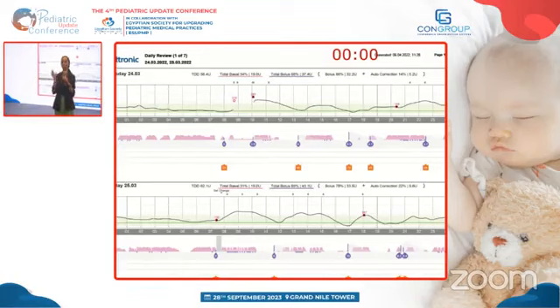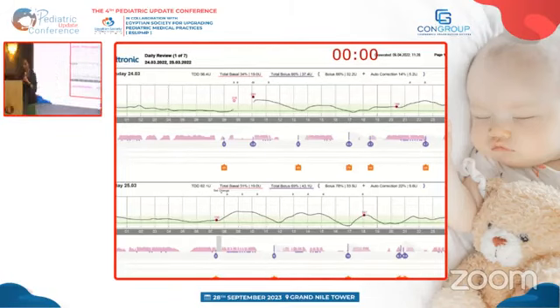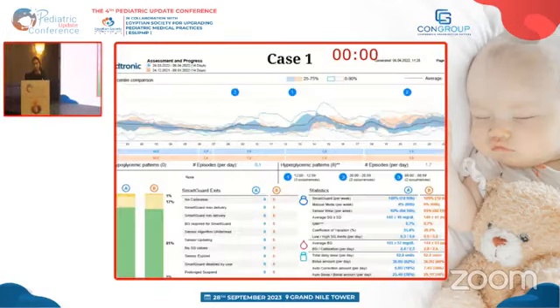كان ناقص من الجرعة. ده حاجة من اتنين: الأول براجع الكارب كاونتنج مع البيشنت بتاعي، لو لقيت إن الكارب كاونتنج بتاعه صح ساعتها على طول بغير في السيتنج اللي هو الكارب ريشيو. لكن لو الكارب كاونتنج بتاعه غلط، بكيب السيتنجز بتاعتي زي ما هي، ما بعملش أي تغيير لحد ما بظبط معاه الأول الكارب كاونتنج، وبعد كده نشوف مع بعض لو احتاج تغيير في السيتنج بنغيرها بعد كده، اوكي.